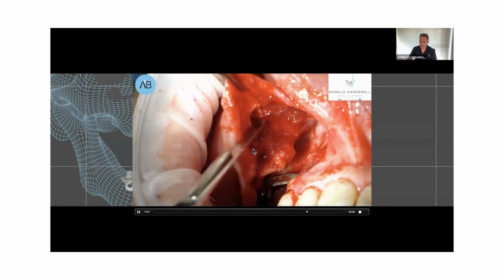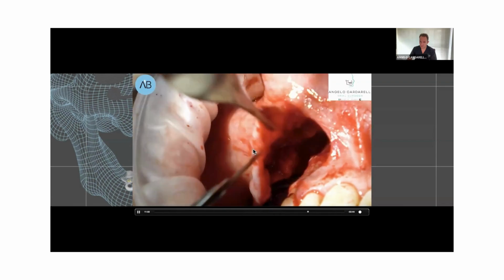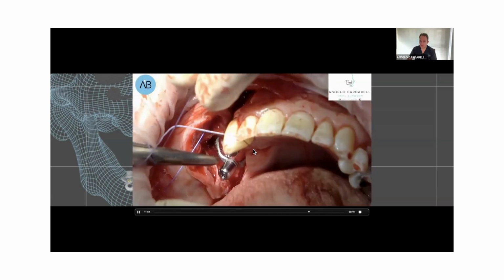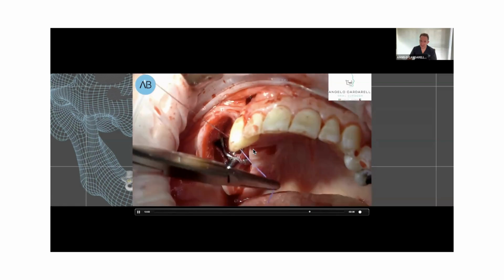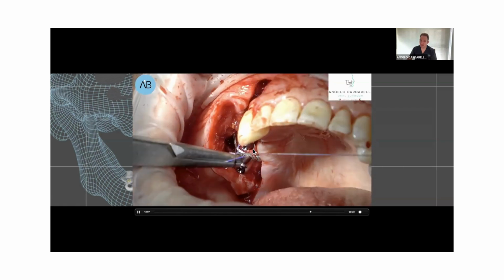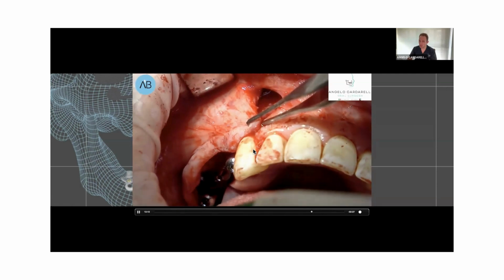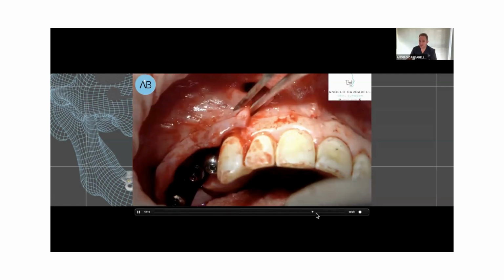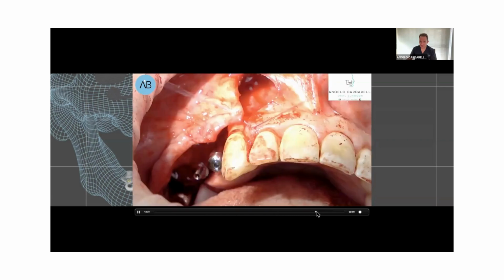More incision. And now have a look with the suture. We can move and we can fix, we can keep the fat on the top of the customized implant, exactly like this. After that, we can complete the closure using the suture to close the flap, like this, okay?